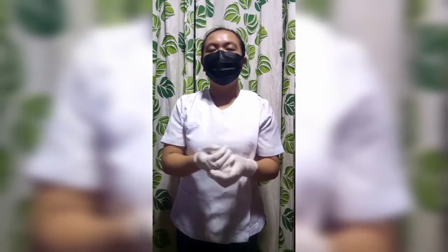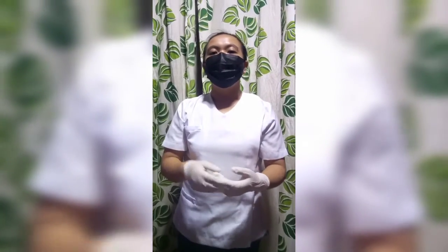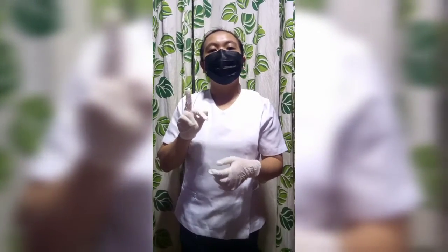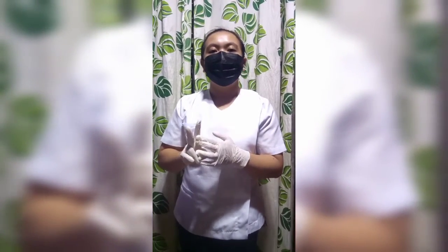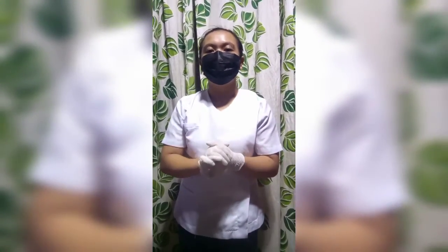After we put on our PPE and perform hand hygiene, the next step is to identify the patient. In identifying the patient, we need two identifiers. First is the name of the patient, and second is to check the identification band or bracelet. We also check the doctor's order. Good morning, ma'am. I am Melva Inacario, your student nurse for today. May I know your name, ma'am? Anla Godin. Okay, may I check your identification band, ma'am?